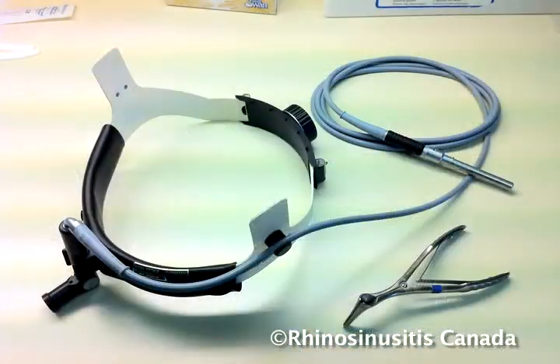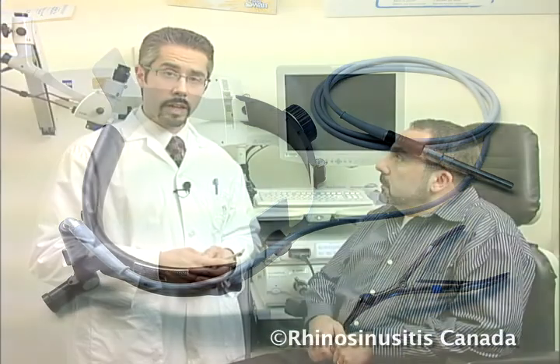The nasal examination is usually performed with a headlight and nasal speculum. However, this equipment is not always available, and we will also describe a technique using an otoscope to examine the nose. If the headlight and nasal speculum are available, these should be used to examine the patient.